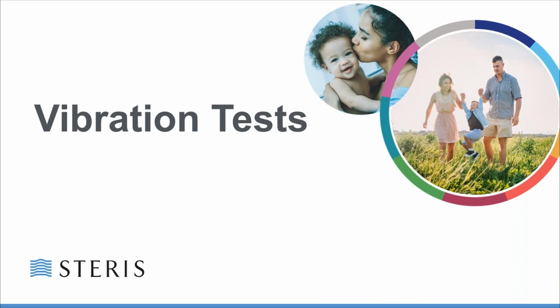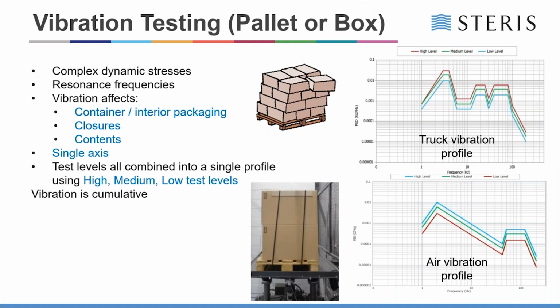In relation to vibration testing, if I jump up and down here in my office here at home, you will eventually get the effects of the vibration because it's transferred through solids, no matter where you are. So if you look at, say, a pallet or a product box sitting in the back of a truck or an airplane or a train or wherever it may be, it's a very complex and dynamic stress, and you can get resonance frequencies within the actual product and the packaging, which can actually destroy each other. So you need to have a look at an assessment of that as well.